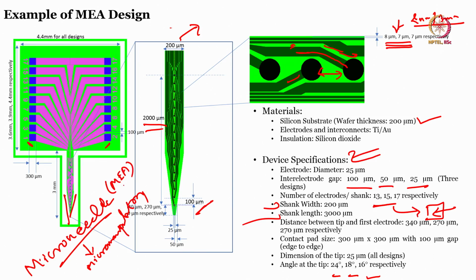It is like the needle of an injection. There is a needle, it penetrates into your brain, and there is a micro manipulator which is used to precisely enter that device into your brain with a few micrometer resolution. That is why it is called a microneedle. Okay. And micro manipulator. So this device is also useful, just to give you an idea.